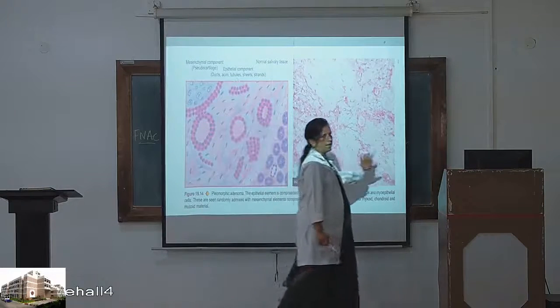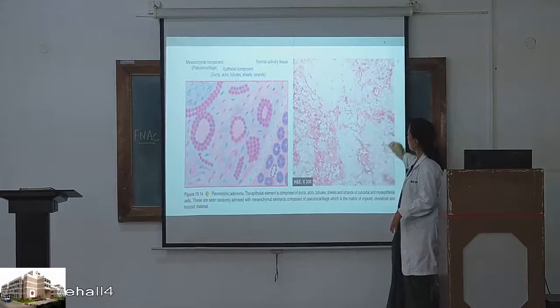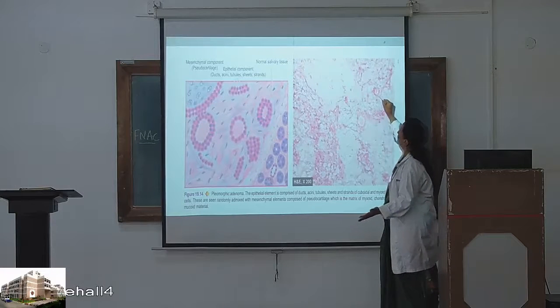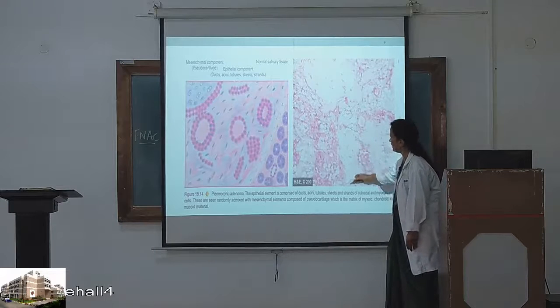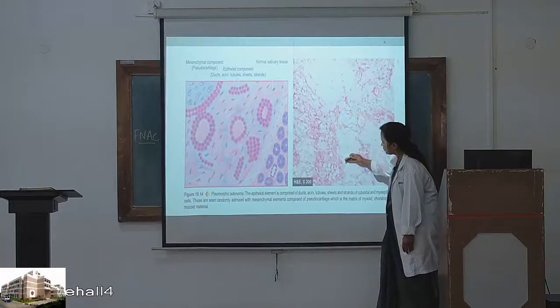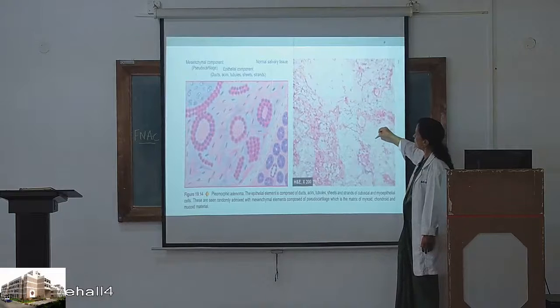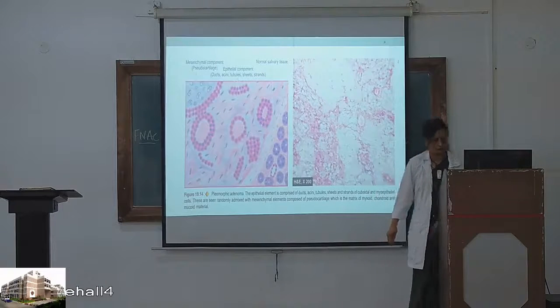Now you have to appreciate that microscopically. All these pink structures are epithelial components. Here you can make out they are arranged in the form of acini, because single layer. This is the duct, it is double layer. Secretions inside, and all these hypocellular areas. See, the cells here are so few. It is pinkish to bluish and there are interspersed cells. These are the myoepithelial cells. So you can call this a myxoid matrix. This somewhat resembles cartilage, so we call it chondroid.